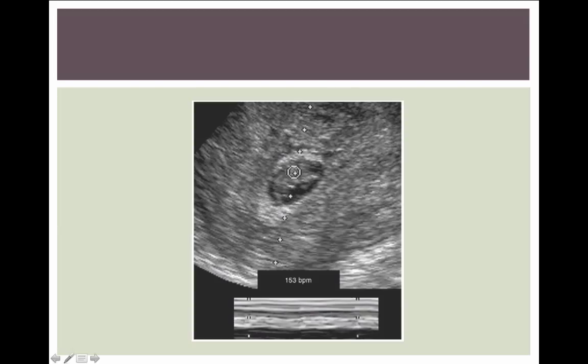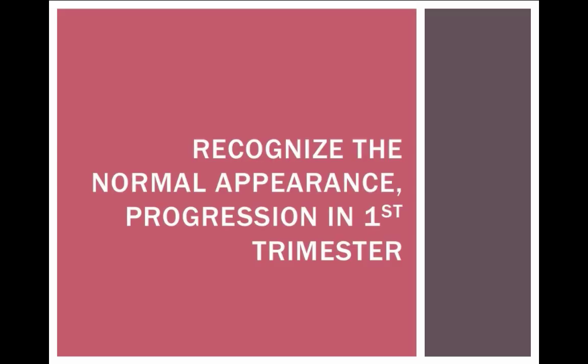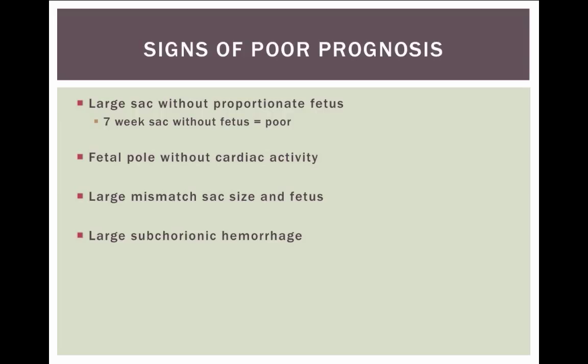Here's an example of fetal demise. We see a sac that's probably too small for this fetal pole, and we tried M-mode and couldn't see any cardiac activity. In this day and age you can just save a clip that's zoomed in and shows no cardiac activity, and then also do the color flow. How do you recognize fetal demise? If you know the normal appearance and progression of pregnancy in the first trimester, this isn't going to be that difficult. Some signs of poor prognosis include a large sac without proportionate progression in the size of the fetus.